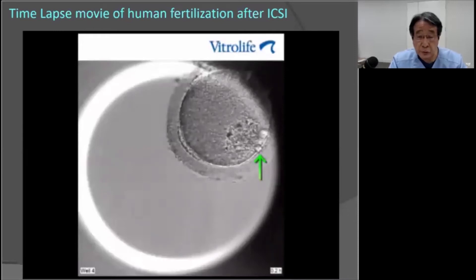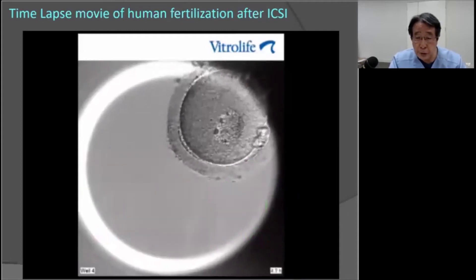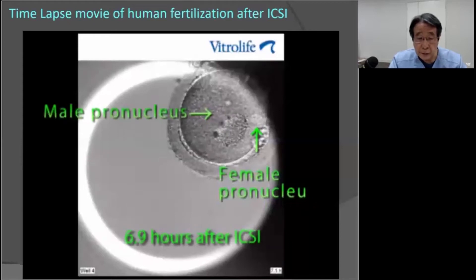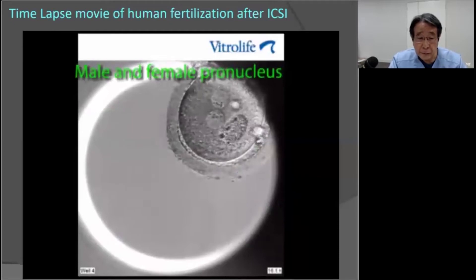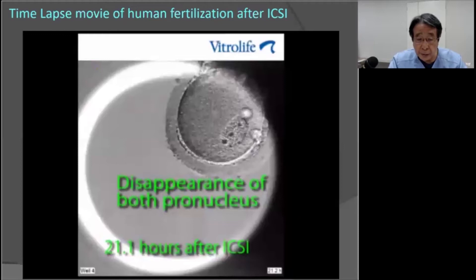This video shows a series of human fertilization. The green arrow indicates the first polar body, and this oocyte is in the metaphase II stage. The second polar body was extruded three hours after ICSI. The female small pronucleus appeared just under the second polar body after six hours, and the male pronucleus appeared centrally seven hours after ICSI. The female pronucleus approaches the male pronucleus with increasing size, and both suddenly disappeared about 21 hours later.